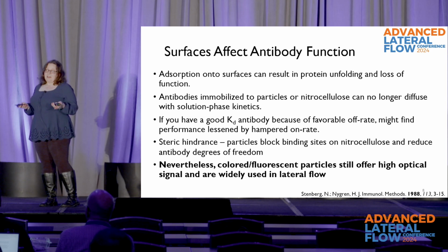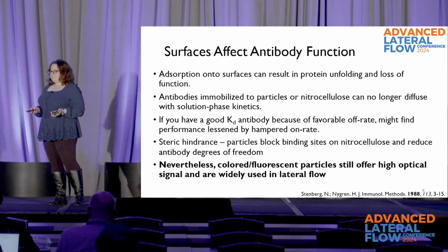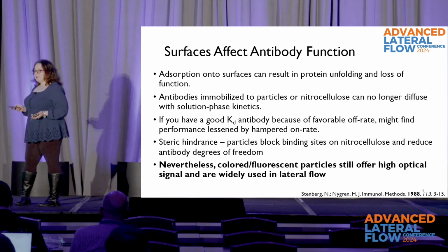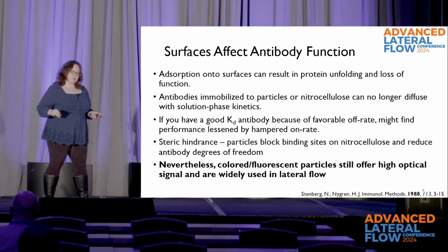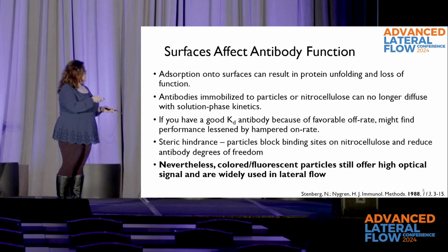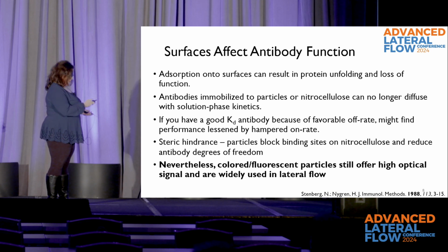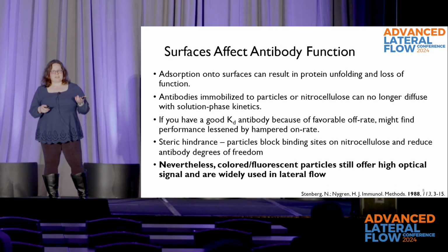Surfaces really affect this process. Adsorption can cause protein unfolding. Sometimes with ELISA, that's how we put everything down onto a plate, right? That's the first step. Sometimes you can lose up to 90% of your antibody activity just by doing that process. So it's just a lawn of protein that's not doing anything because your Fab region is destroyed. And the thing about that as well is, look at how little this guy is, and look how big this guy is. Latex doesn't weigh very much, it's not very dense, but it's big. So when you have this diffusing through solution, and then going through the pores of your nitrocellulose, it's really going to slow it down.